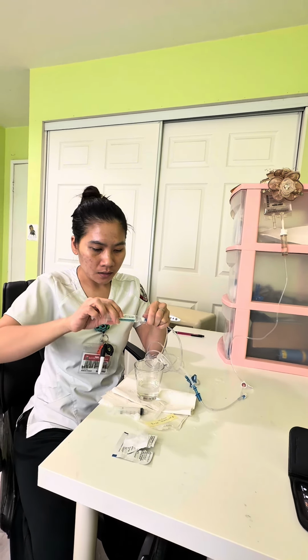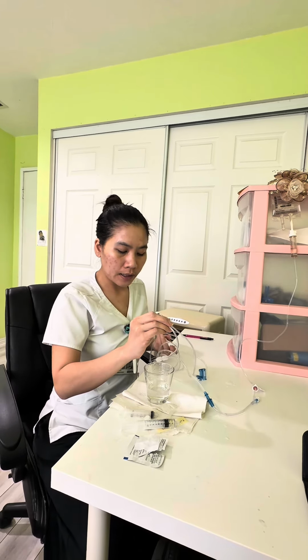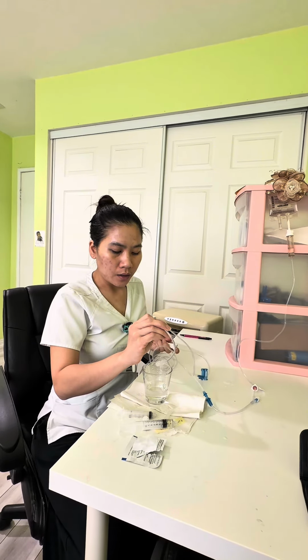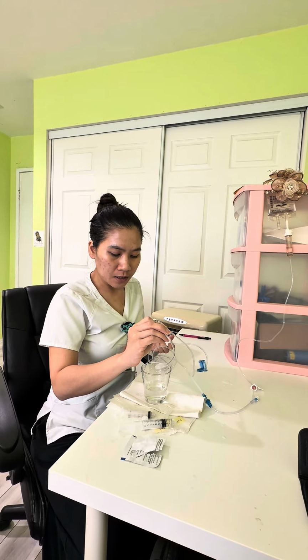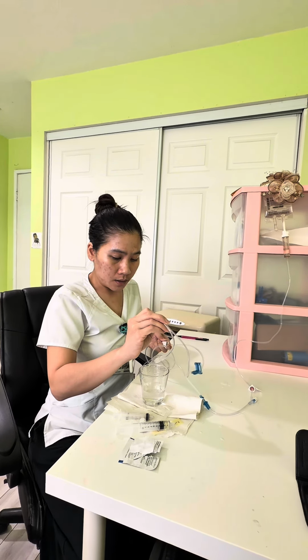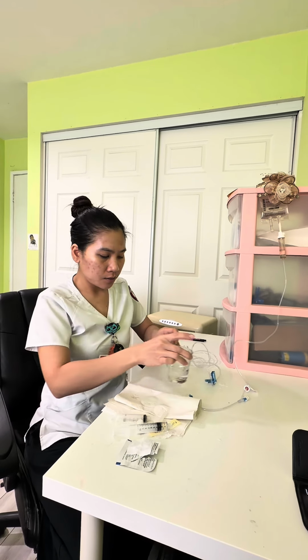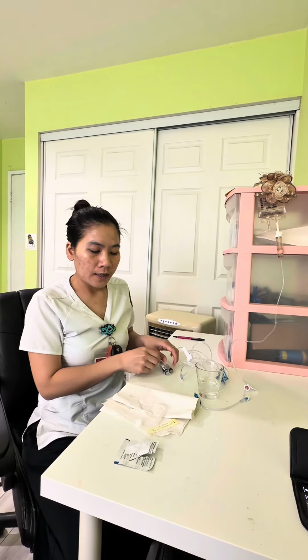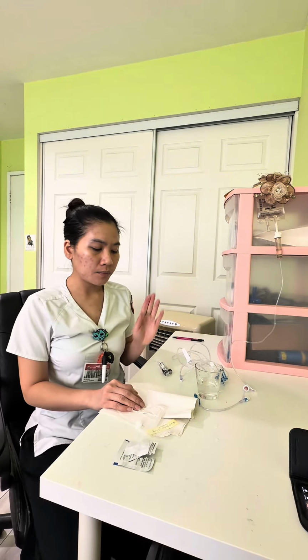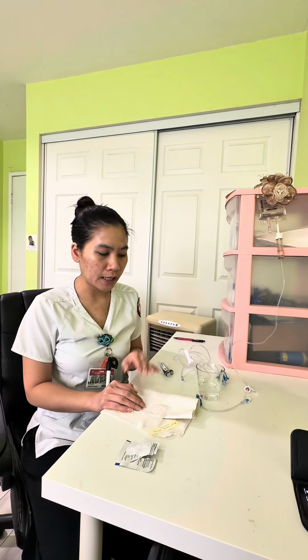After that, I'm going to unclamp the tube and then restart the running IV solution at the original rate. I assess the patient for any sign of discomfort, swelling, or redness. After assessing the patient, I go ahead and empty this into the sharps container and then document the procedure I have done, the medication I gave and the doses, what IV site I gave it in, and also how the patient tolerated the medication.